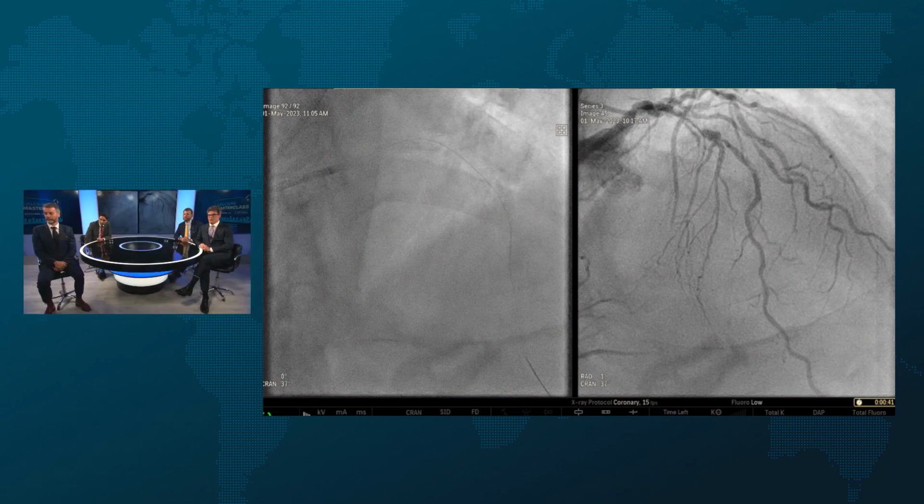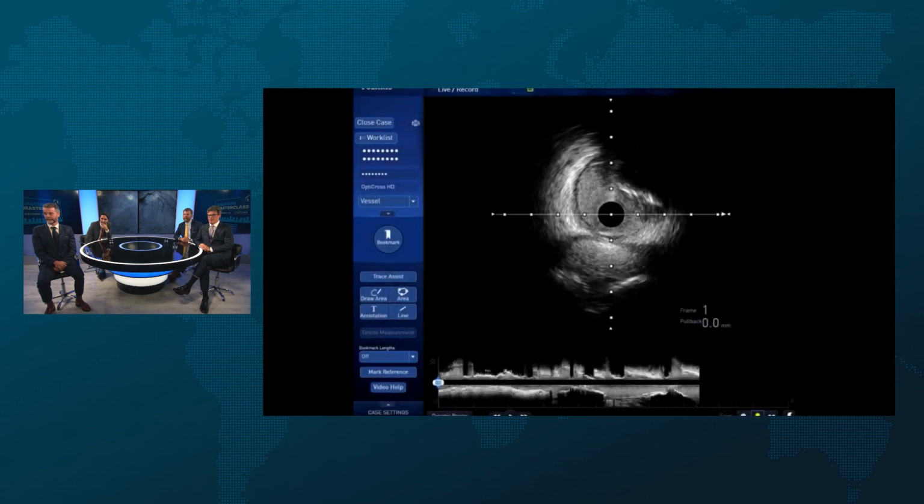It's interesting, isn't it? Look at that nodule on the fluoro on the right. Just a classic translucent. Okay, got it? Yeah, we're there.